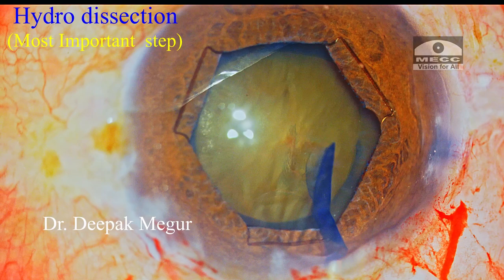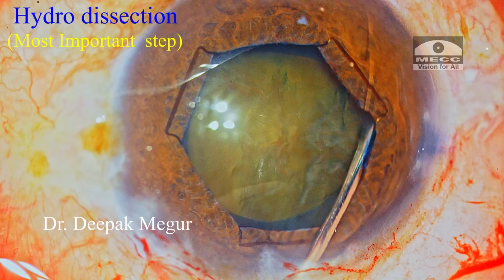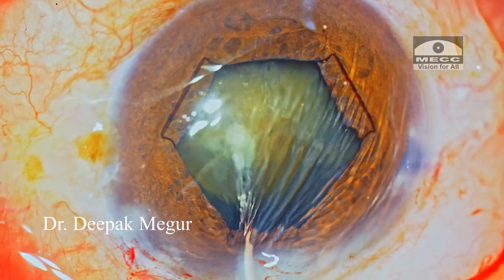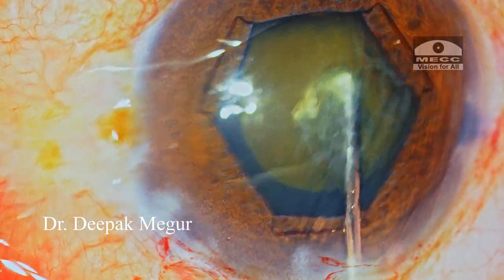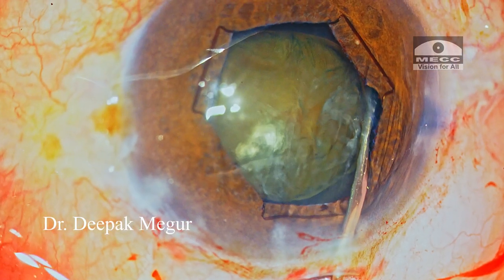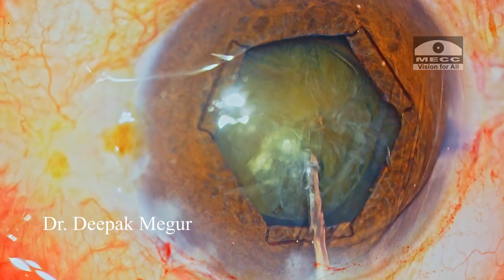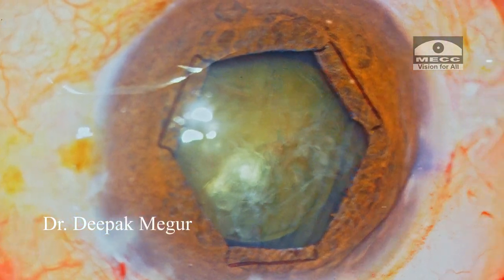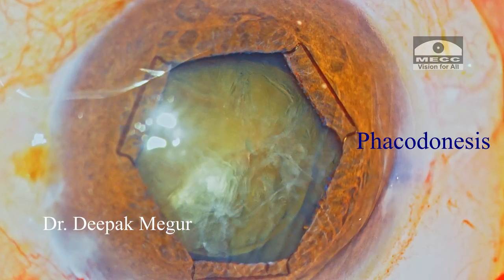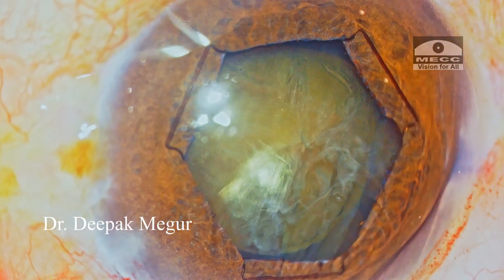The most important step in the surgery is hydrodissection. We want the cortex and nuclear complex to be totally devoid of any attachment. When I am trying to decompress the lens and rotate the nucleus, I can see that the entire bag is moving. It's time to go back and repeat hydrodissection and test again, but I'm convinced the nuclear complex is still attached to the capsular bag. So now the next most important step: I want to put in the CTR so that the bag receives equatorial stretch and support.